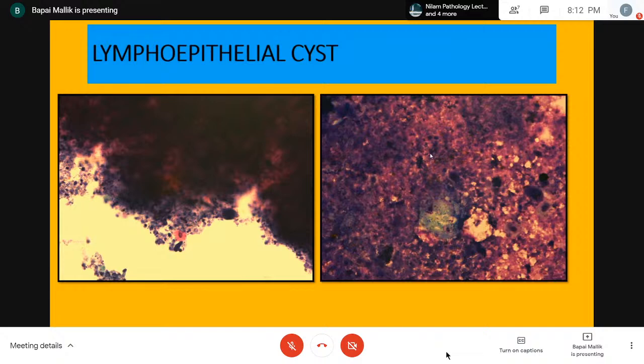Now, this is a very tricky lesion, because if this particular slide comes under my microscope, I just look at this dirty material. I might just pass it off as some kind of acellular material, maybe coming from a pseudocyst, I don't know. Whenever you see this dirty material from a pancreatic cyst, you should look very, very carefully for the presence of ghosts of squamous cells.